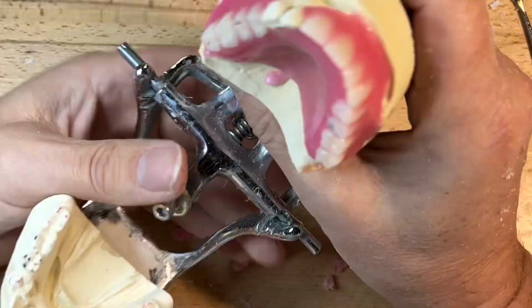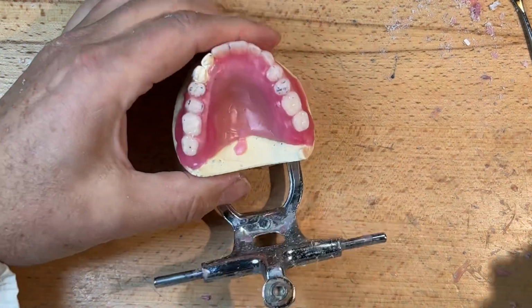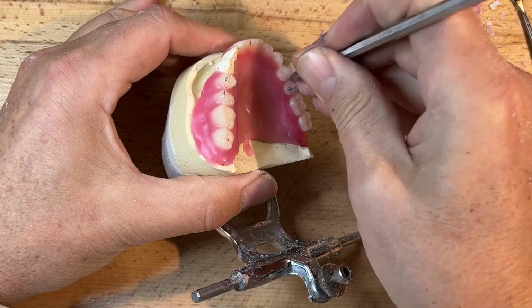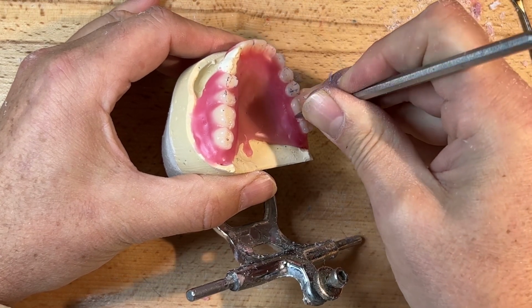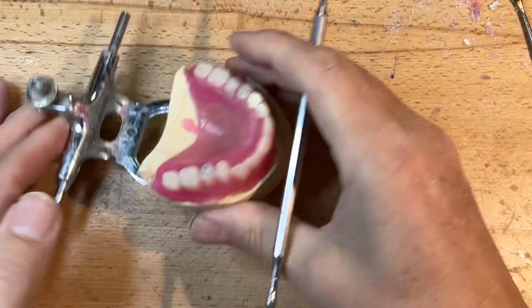So we can take this off. Use your favorite wax up tool, whichever you find the easiest. I'm going to do the linguals. I'm going to be careful, the wax is a little bit soft, but it won't stay that way for long.